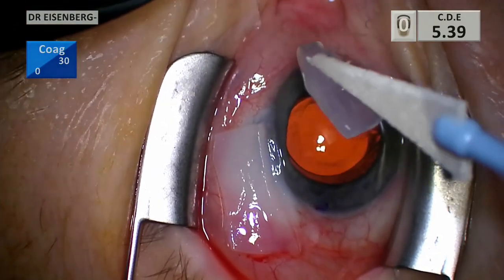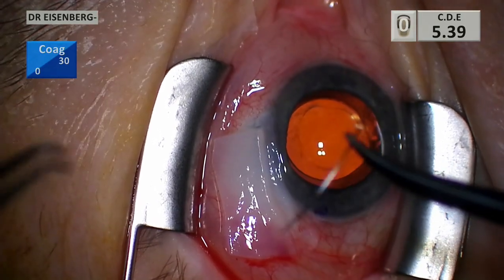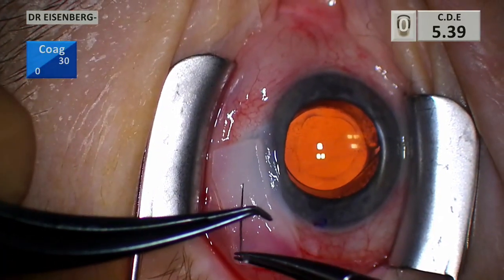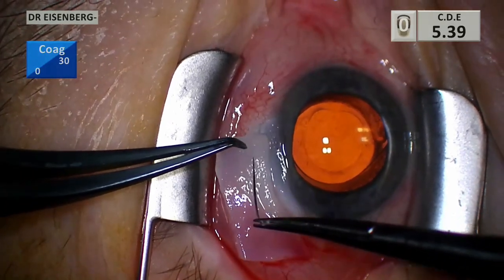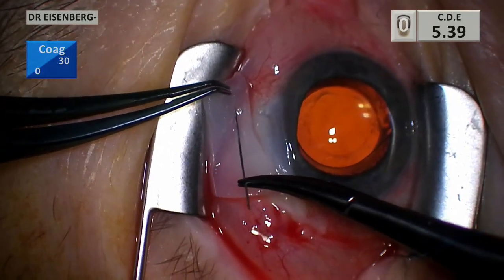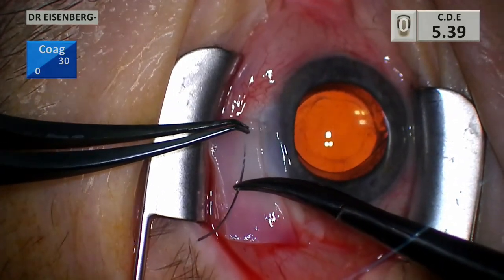The goal is to place this epithelial side out. Do I have empiric evidence that this is absolutely necessary? No. It probably works the other way too — I've just always done it epithelial side out; it kind of makes sense to me. I've probably placed some upside down inadvertently as well, and they all tend to work.